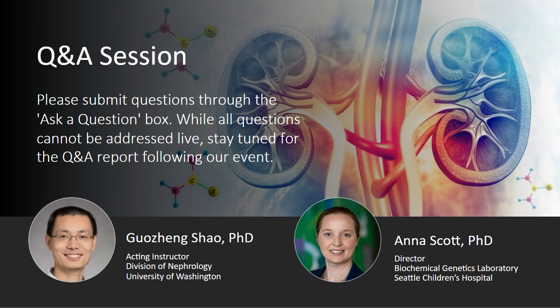Thank you for that question. We are doing bovine blood test for 24 hours, and actually much longer than 24 hours. And we're testing that for a few days. The purpose is, number one, to confirm the urea removal rate. Number two is to confirm the safety of the device. But that's also a more complicated scenario because of coagulations and quantifications of the retention solute.